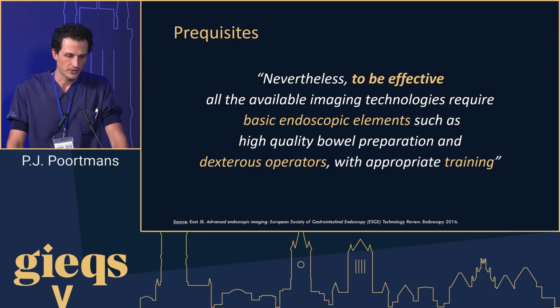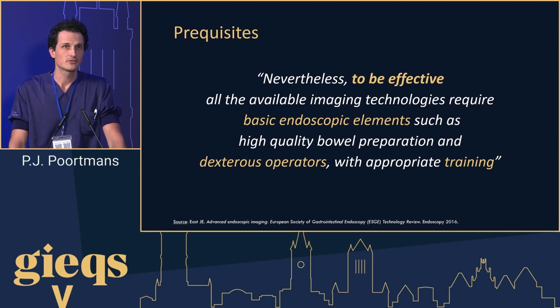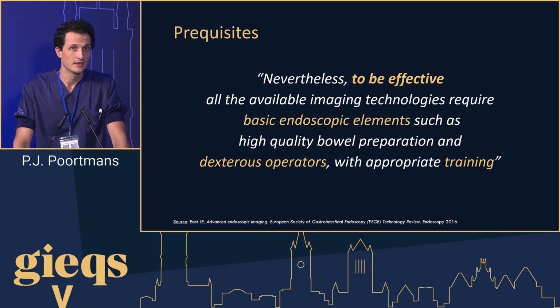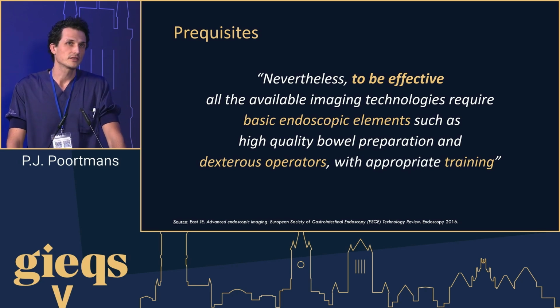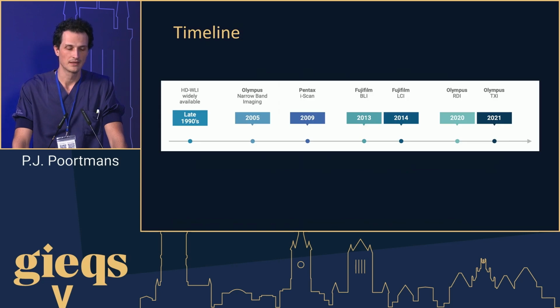Maybe a nice prerequisite from the ESGE technology review from 2016 is that to be effective, all of these imaging technologies require some basic endoscopic elements, such as a high quality prep, but also people that know how to do colonoscopy and are trained to use these imaging technologies.